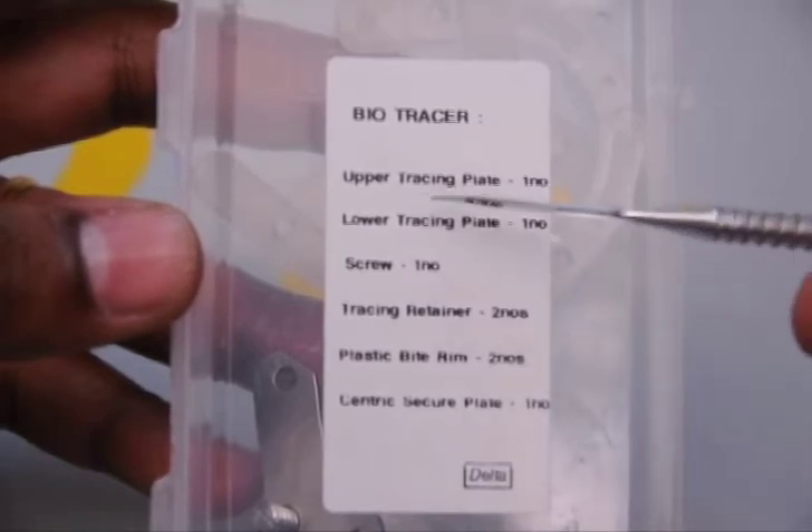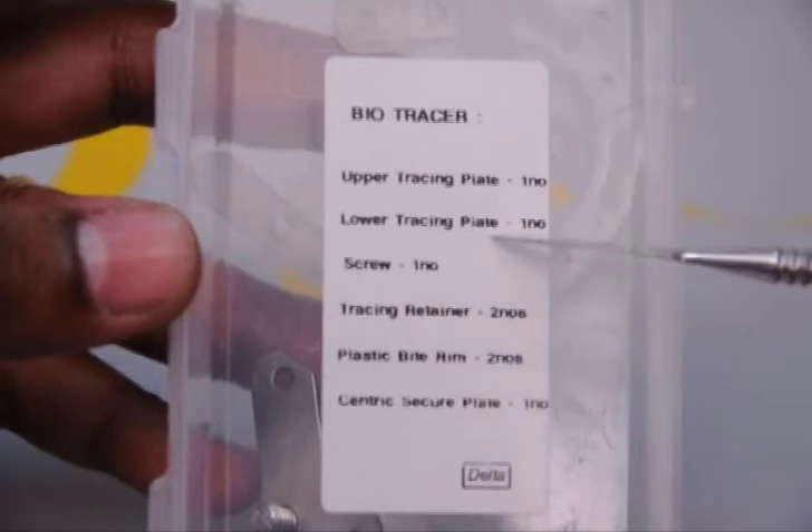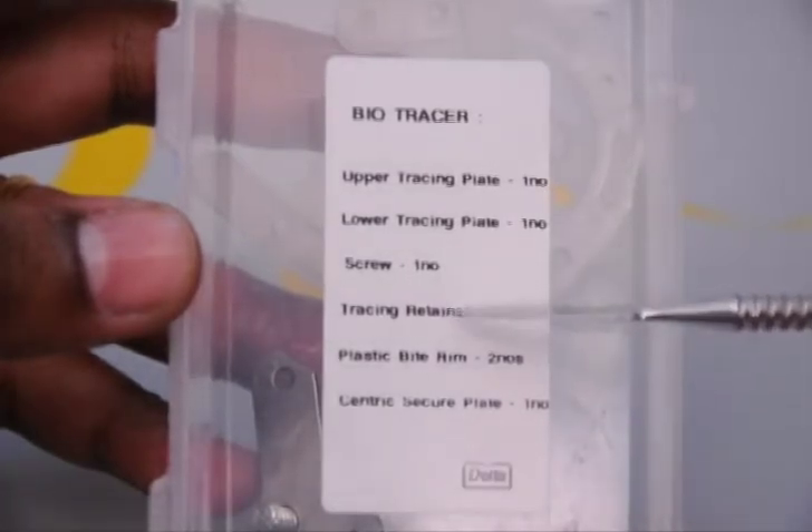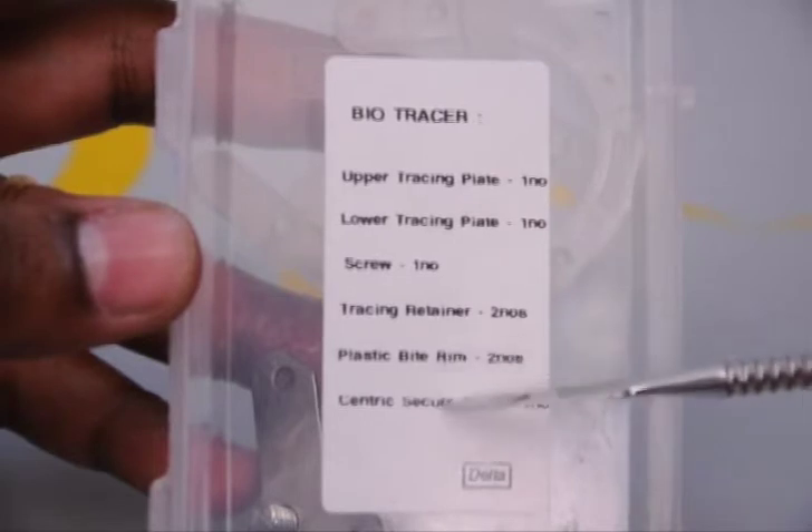The 6 components include the upper tracing plate, the lower tracing plate, the screw, the tracing retainer, the plastic biter, and the centric securing plate.